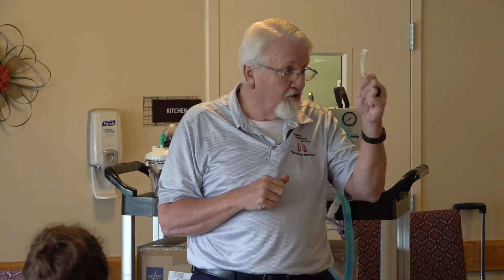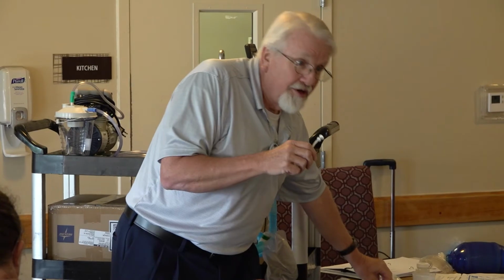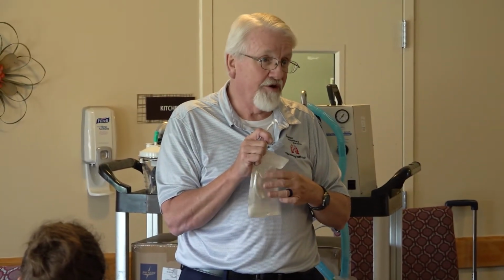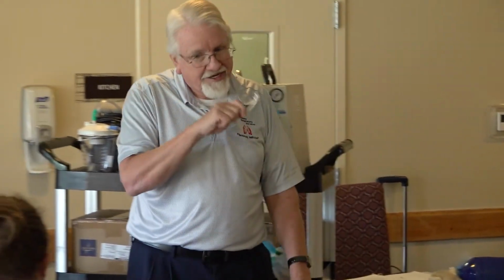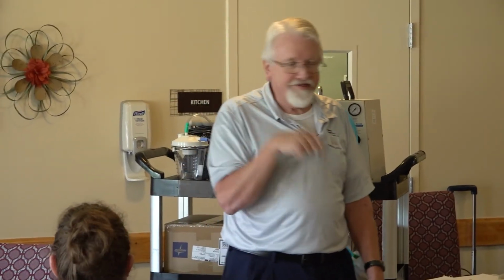You should always send the obturator with the patient. If they're leaving your building, this should go with them to EMS. The downside of that is, you're probably never going to see it again. But if you have, which you will, a backup trach in every patient's room, there's another obturator in there. So make sure you send that if they go out, and don't raise sand when it doesn't come back with them.